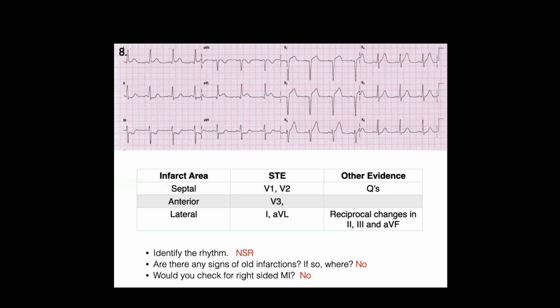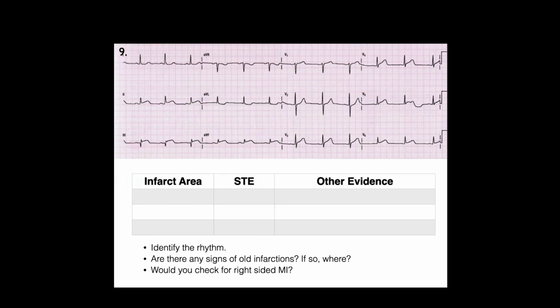Okay, and then check for right-sided leads. No. Okay, good job.